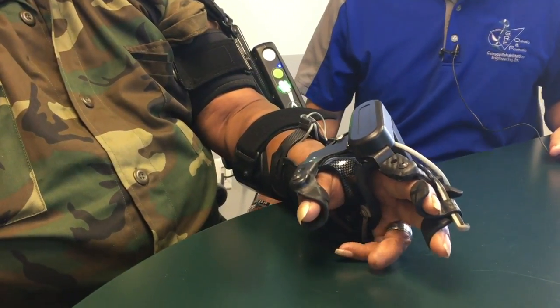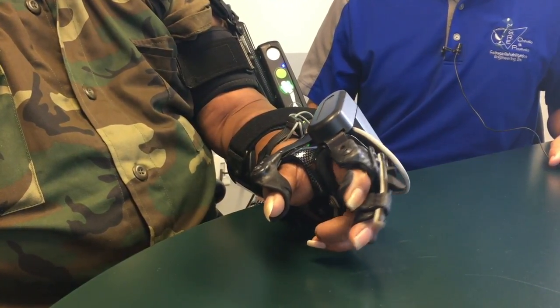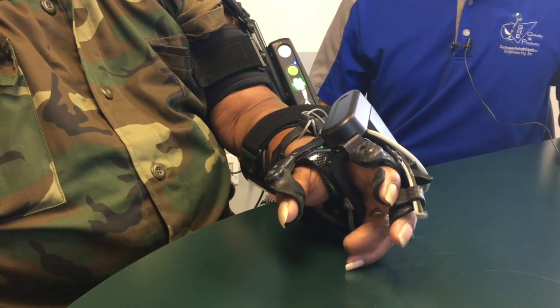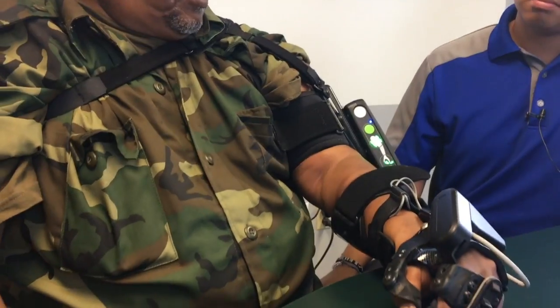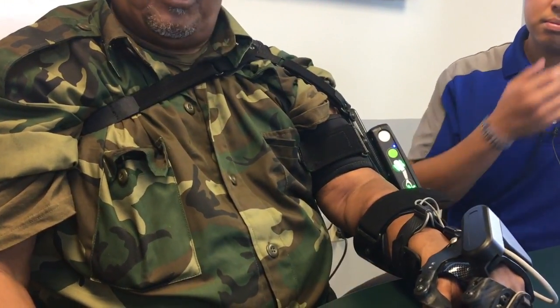Basically what I could do that I couldn't do before — I could open and close my hand. As you can see, the movement is very easy for me now, where before it was so difficult I couldn't open my hand. And the same with my elbow, to raise it up and down when I couldn't do it before. This has gotten a lot easier using the device.